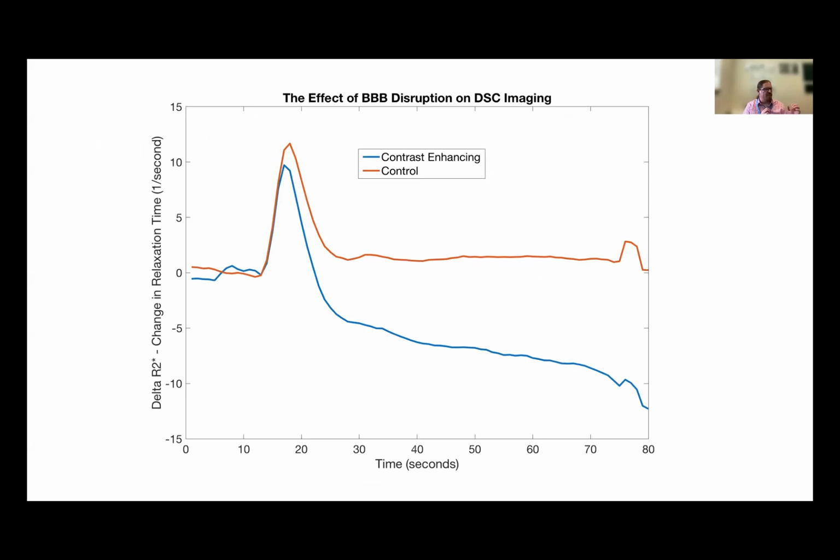Now, if you put a region of interest in that area and compared it with the contralateral hemisphere, you'd see that same thing that was described in the brain tumor literature, where the signal is being pulled down, the blue signal here, and red would be what it would look like in the absence of blood-brain barrier disruption, where the signal is purely due to the intravascular blood flow and the gadolinium related to that. So you can separate these two out, take the perfusion signal and separate it from the blood-brain barrier signal. And when you isolate the blood-brain barrier signal, you get something called K2.